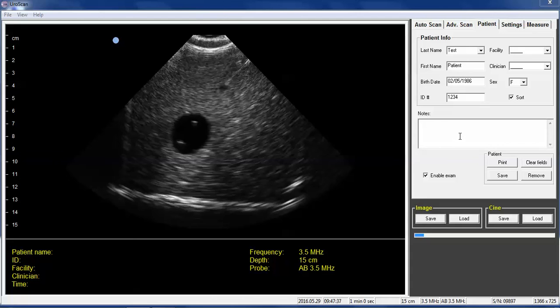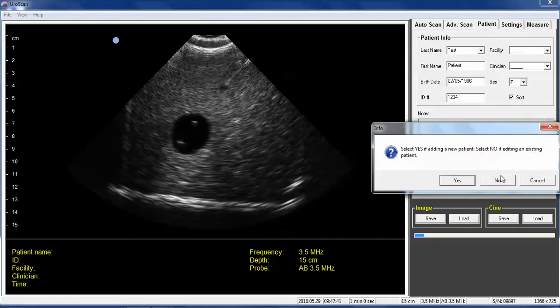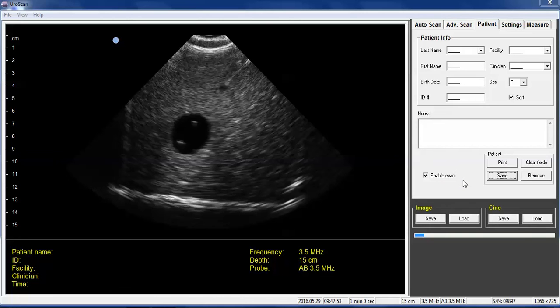After you have the patient information put in, you can push the Save button. It'll ask you to select yes if adding a new patient, select no if editing an existing patient. So I want to select yes to indicate that I'm adding a new patient. Now it looks like the patient did not save, but it did. I have two patients in here, the one that I just entered and one that I entered earlier.